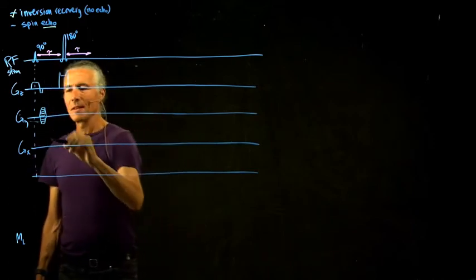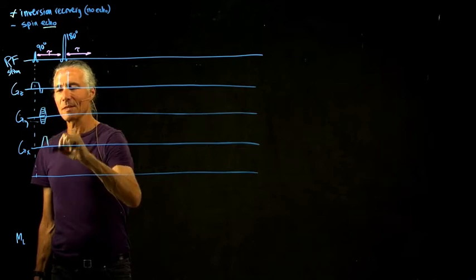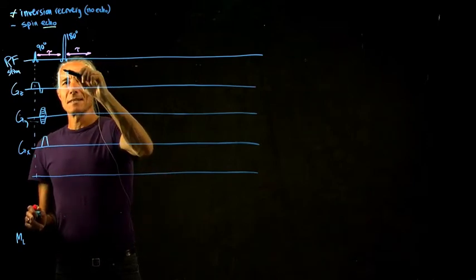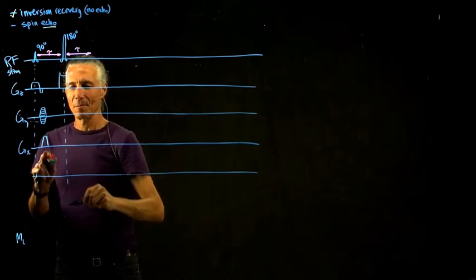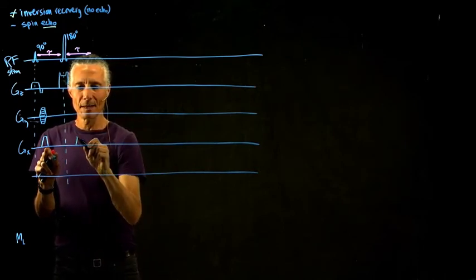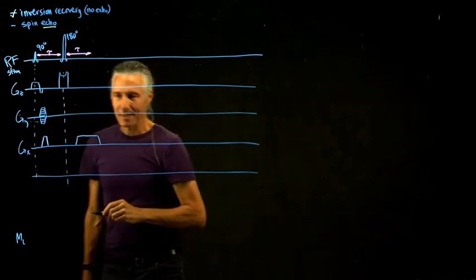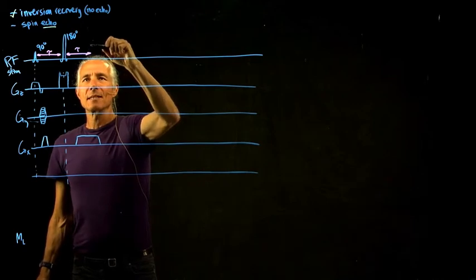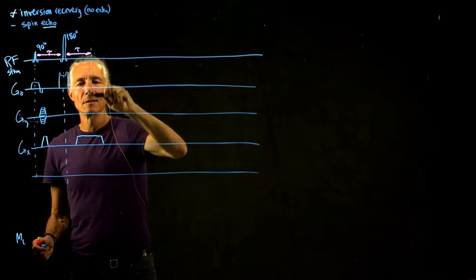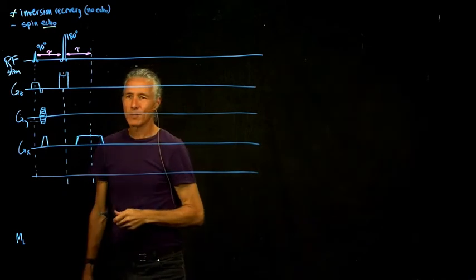And then we have to do a readout. And because we've got a spin echo, we go to the corner of k-space, which we haven't explained yet. And we do a positive instead of a negative. And then right around here, we do our readout. And that's also positive for reasons that we'll explain later. So basically at this point, we want to be in the middle of our readout. Okay, so this is our basic spin echo.